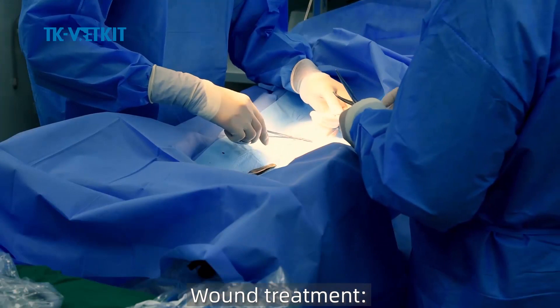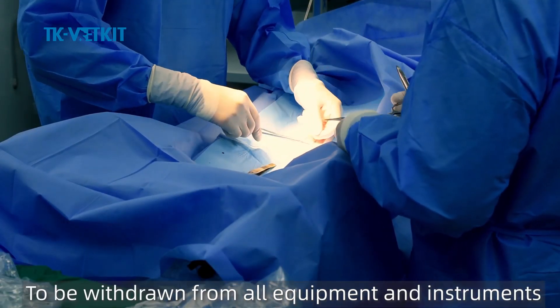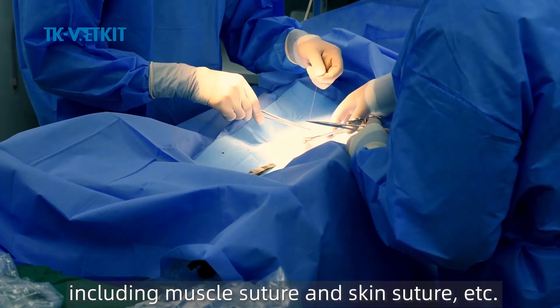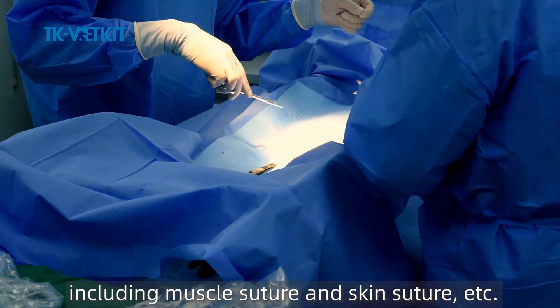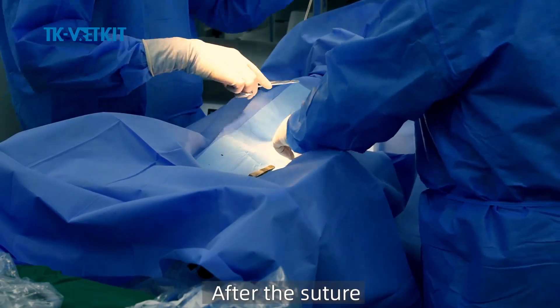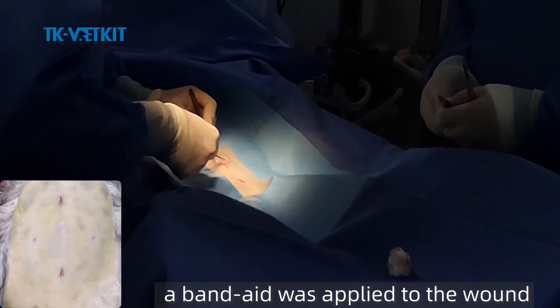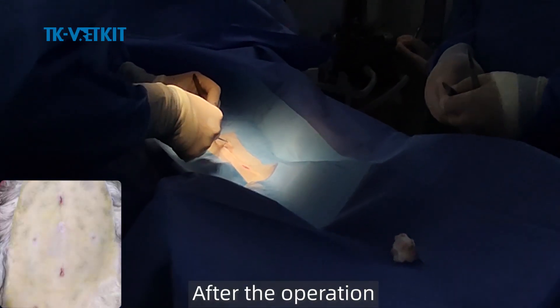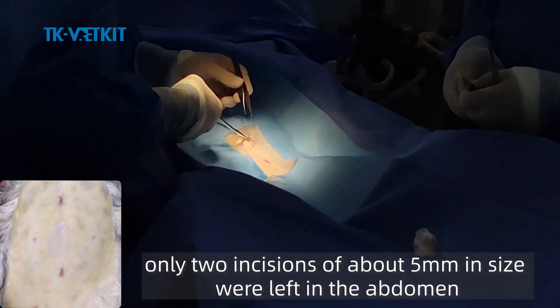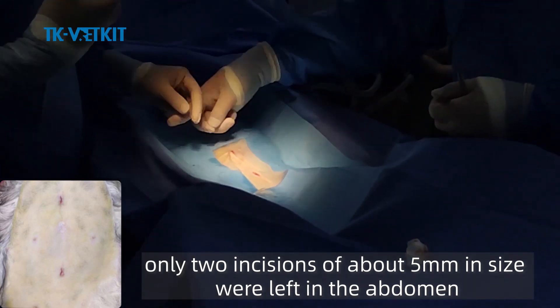Wound treatment. After withdrawing all equipment and instruments, wound suture treatment is performed, including muscle suture and skin suture, etc. After the suture, a band-aid is applied to the wound. After the operation, only two incisions of about 5 mm in size are left in the abdomen.